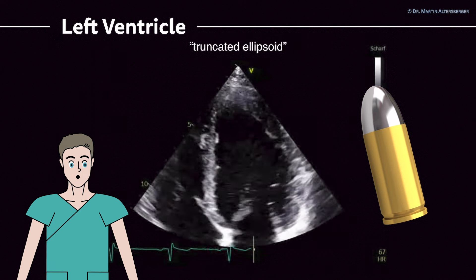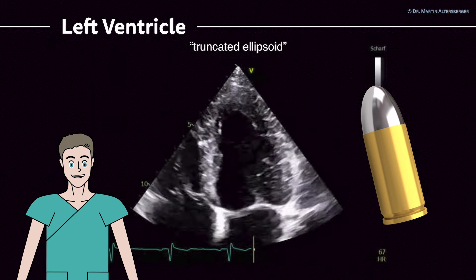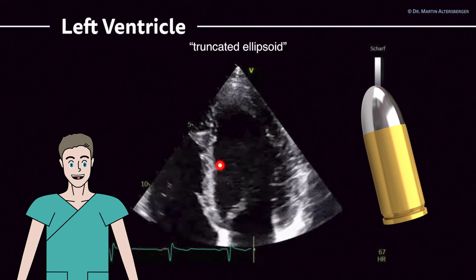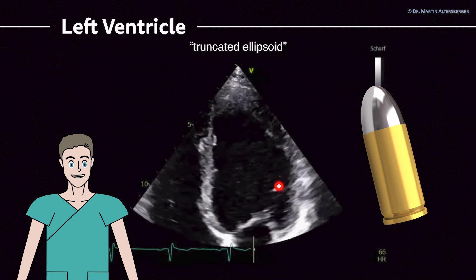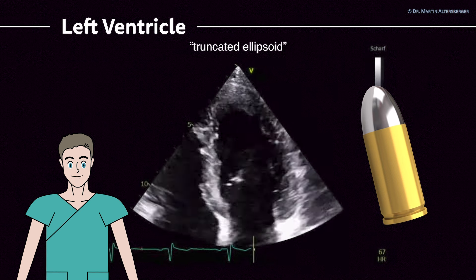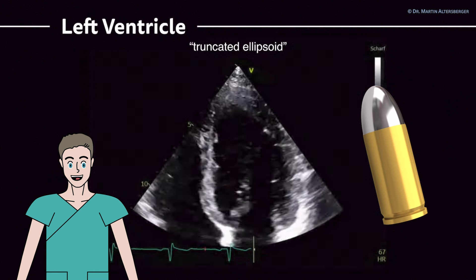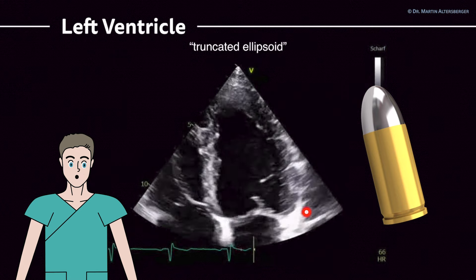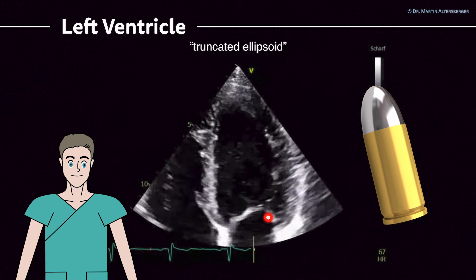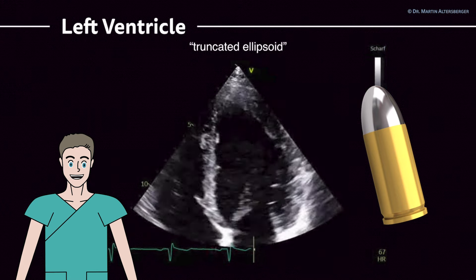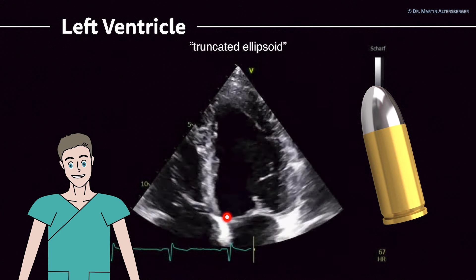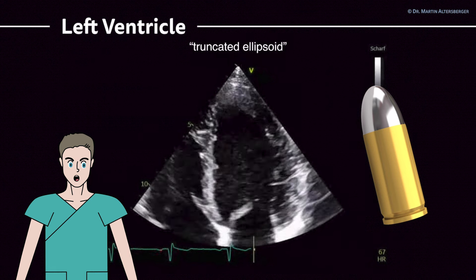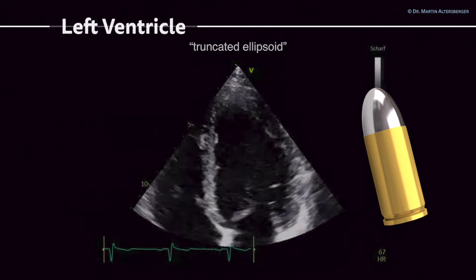The contractility of this left ventricle is fairly good. The ejection fraction is in the range of 55 to 60 percent, and you can see that all walls are contracting quite nicely. This is a focused view of the left ventricle where the atria are completely cut off, giving you the advantage of seeing the ventricle in an optimal position.